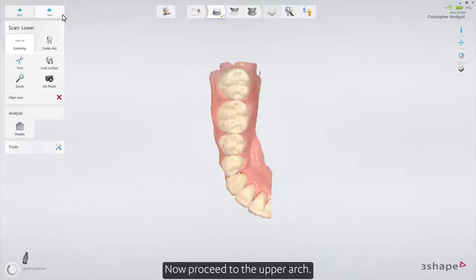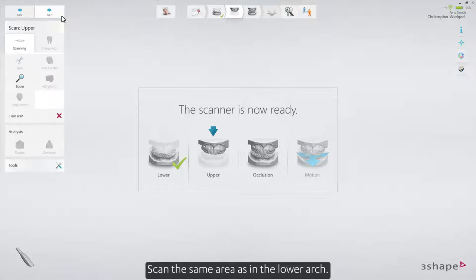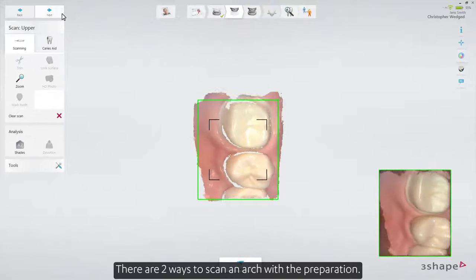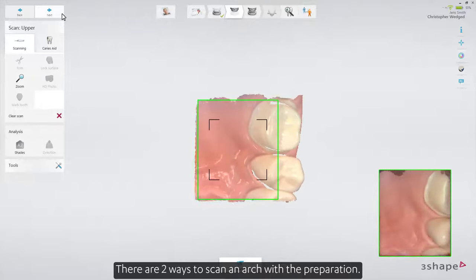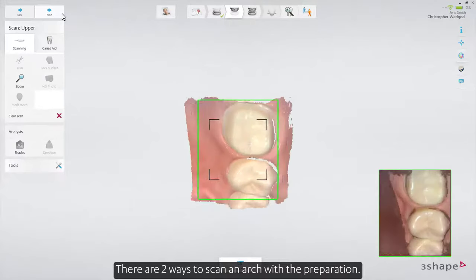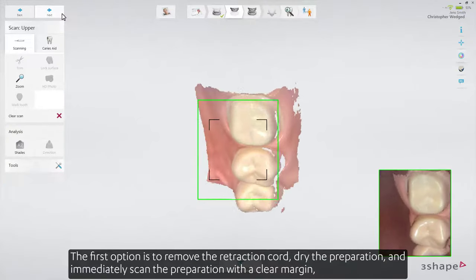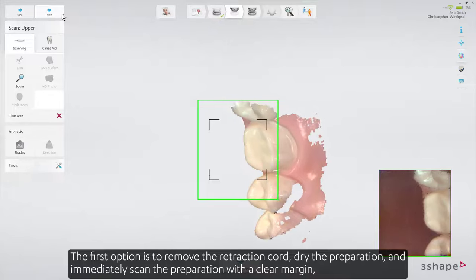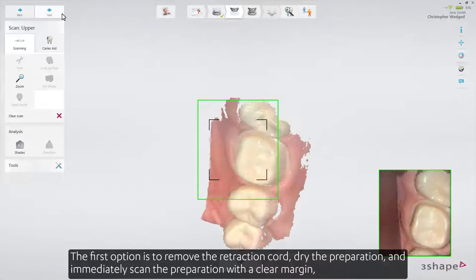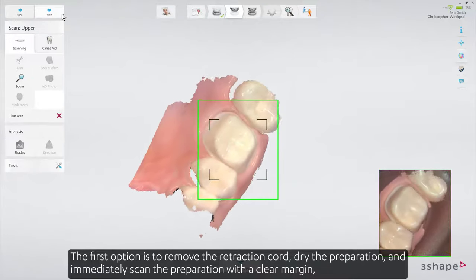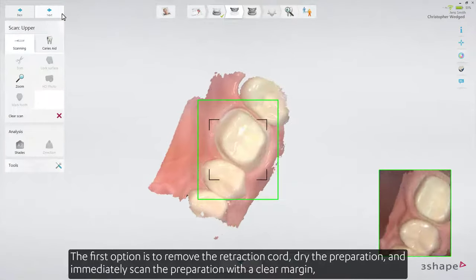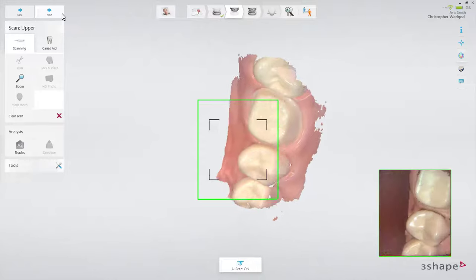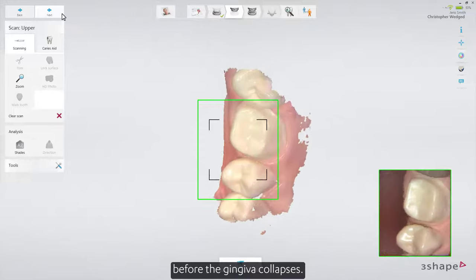Now proceed to the upper arch and scan the same area as in the lower arch. There are two ways to scan an arch with the preparation. The first option is to remove the retraction cord, dry the preparation and immediately scan the preparation with a clear margin before the gingiva collapses.